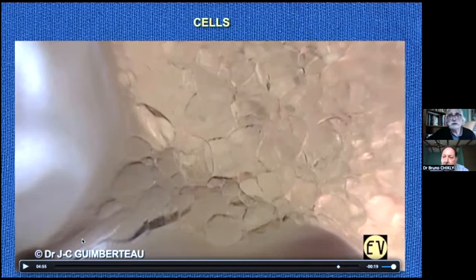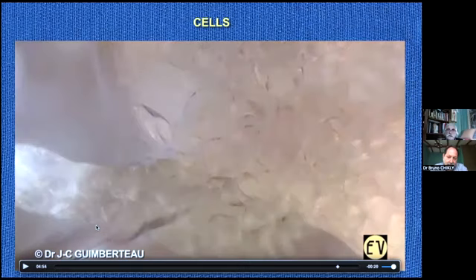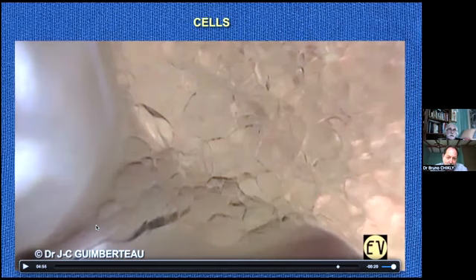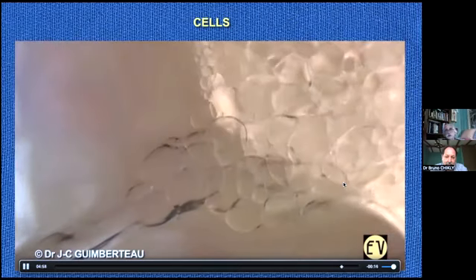Well, for me, it's difficult with my endoscope to prove that the fiber is going inside. We know with histology that it goes through the fiber, which is here. Sorry. Wow. The fiber is disappearing inside the cluster of cells. So it's a world.